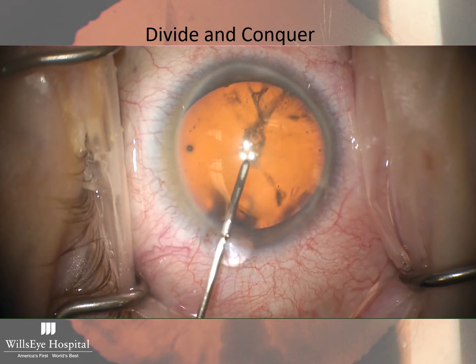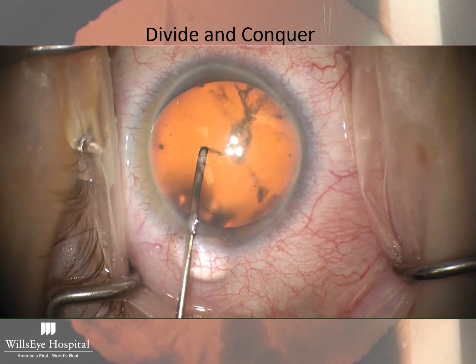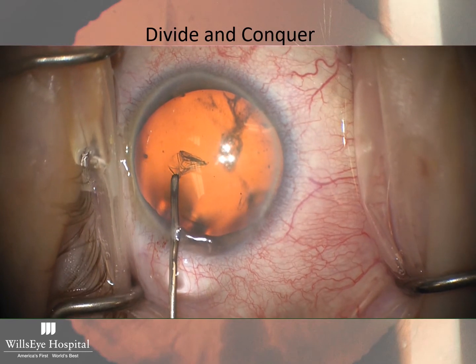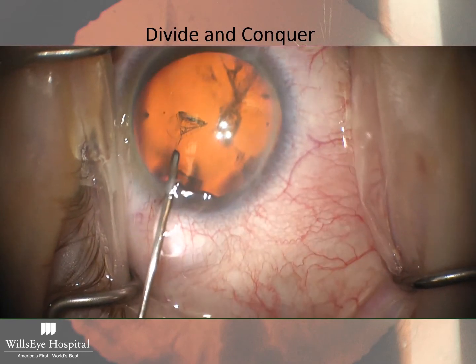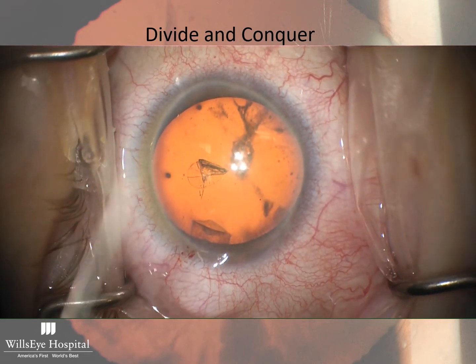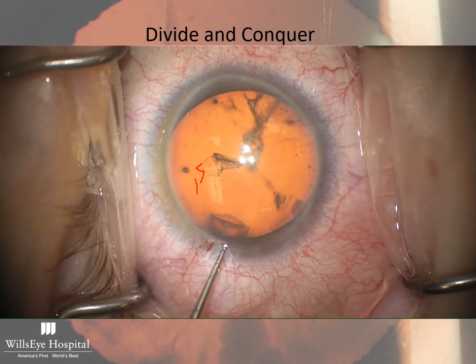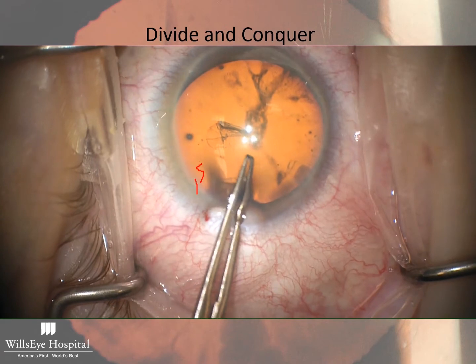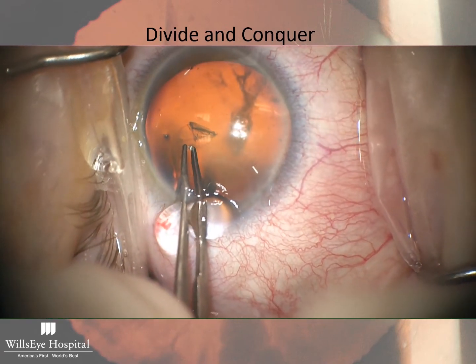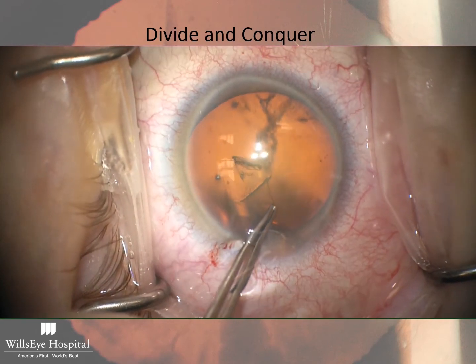I'm using the cystotome. You can see I turn it to the side as I go in, starting centrally, working my way out, and then I start to pull down before my intended site of a capsular radius. You can see I started to pull down approximately here, but here is the edge of my capsule, right? And so that then allows me to set my radius properly. If I pull down too far, then too late, then I'm going to have too wide of a rhexis.